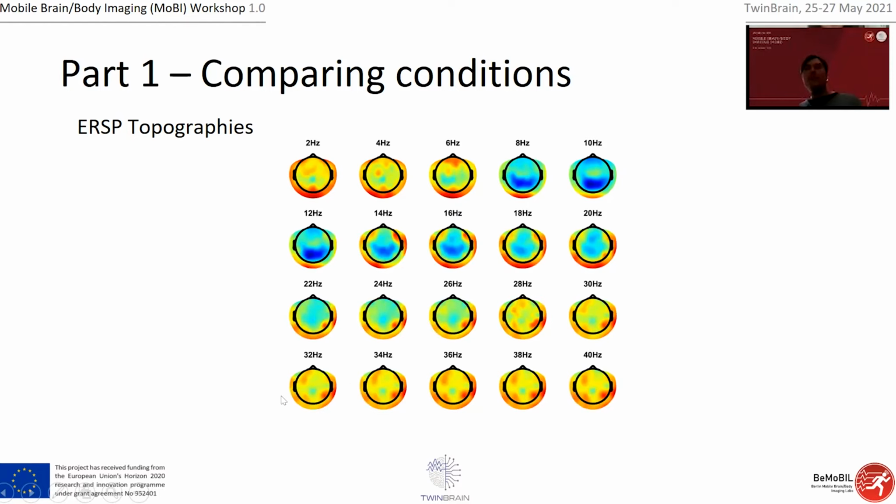If you look at the topographies for these higher frequencies, starting at 30 Hertz, it is more or less always the same picture, because it's really averaged data, and I think it's muscle activity. If it's really broadband and always affects the same areas, that should be the same topography. So it's kind of a boring thing because it's broadband.